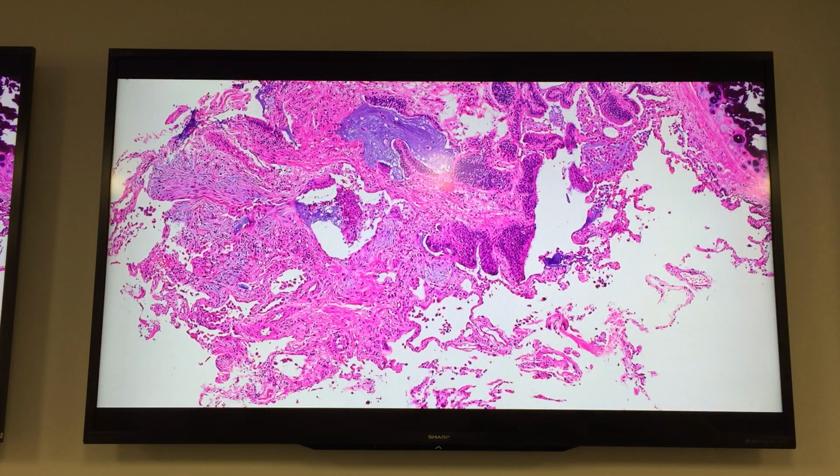Now, do you see on the left-hand side there's some fibrosis in that piece? So that piece has a finding known as fibroblast foci, which are these little areas of fibroblast proliferation. And there's interstitial fibrosis, and there's a small focus of honeycomb change. I won't go into details, because you'll learn this more when you do lung pathology, but this is a very difficult diagnosis to make on a small lung biopsy, on a transbronch. Usually these patients need a bigger surgical lung biopsy. So if you can make it on a transbronchial, you're saving the patient a bigger procedure.